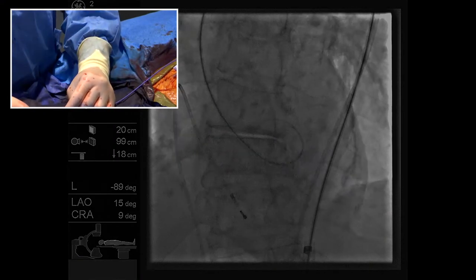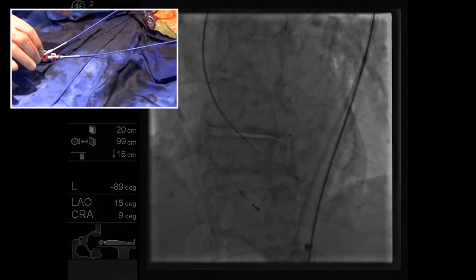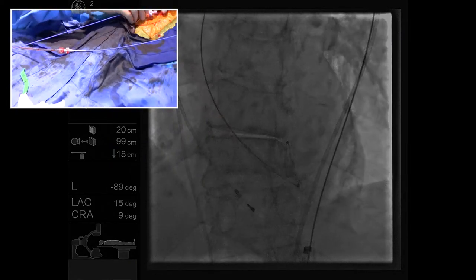And you're gonna, are you okay? Okay. So I'm gonna have you take this out. Sure. All right, I'll hold the sheet. So the wire curls up nice and safely in the ventricle. Oh, we don't wanna lose that. Okay.